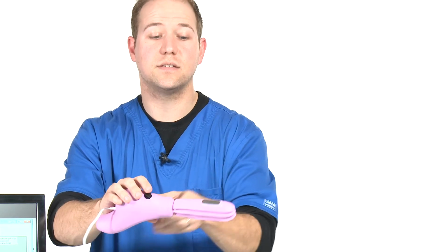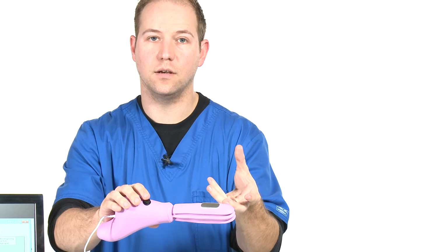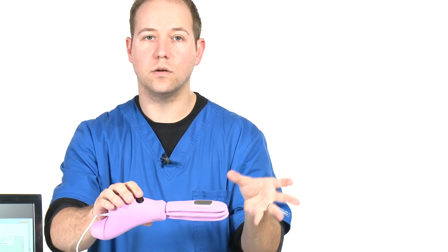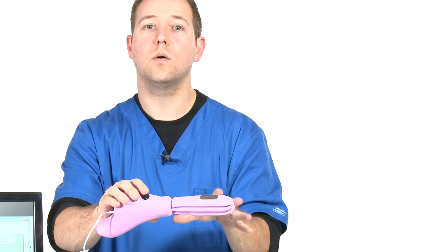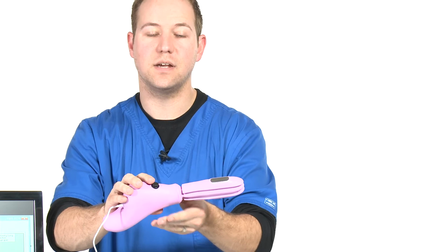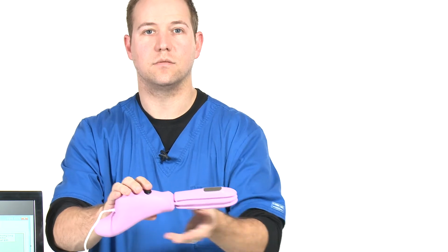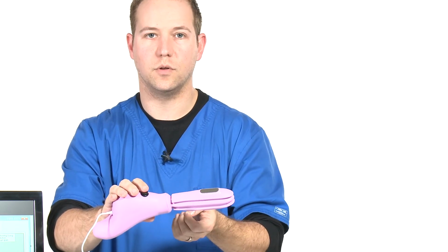They're going to ask, does the stimulation, what does it feel like? You can tell them that it feels like a tingle and then a tug. It will not hurt the patient. You always want to make sure that the patient is aware that when they're actually utilizing their InTone, that they never take the device out in mid-use. If they do, it'll feel very uncomfortable because the stimulation will be delivered in a very uncomfortable area.